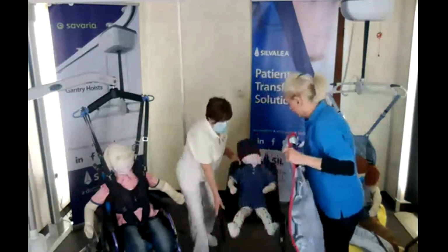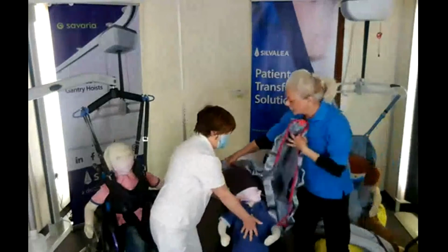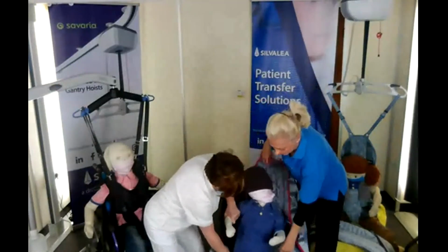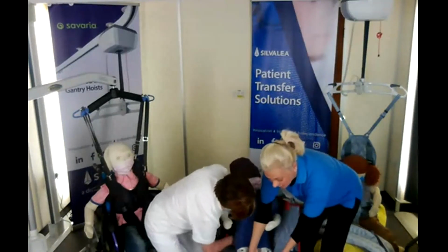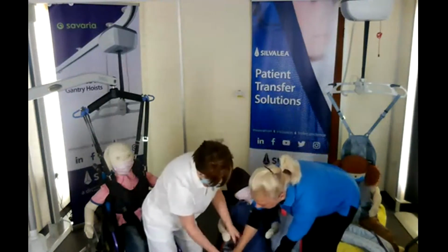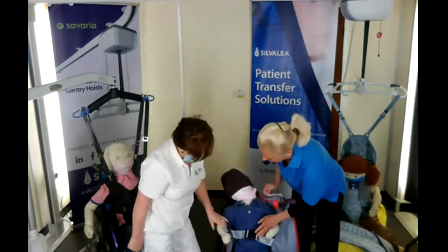I'm just going to put it on. It's very difficult to explain without a proper person, but it applies like a sling. We'll do it in the chair. You can take that side, Jude. And it can just be scissored underneath. There is a little pocket, which I'll show you when I lift it up. The leg sections come through as a sling would. So through, there is a waist support. We just couldn't put that on, and that helps to keep it in, to position it.